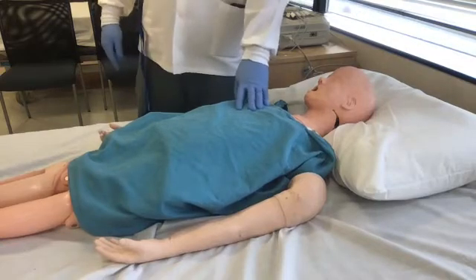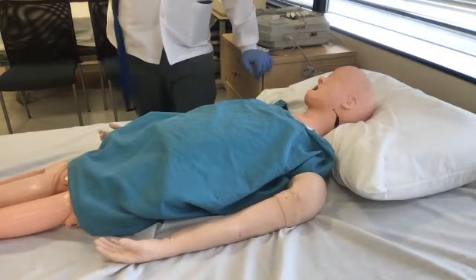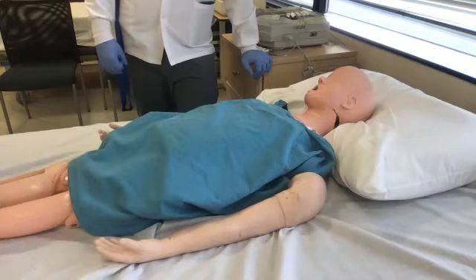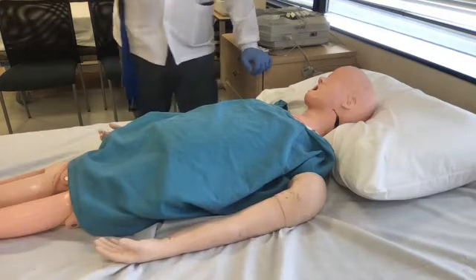So identify who he is. Then I have to tell them who I am. Hi, Mr. Marquez. My name is Nelson. I will be your tech today. Dr. Cassidy wanted me to perform an EKG on you. Is that all right? Have you had one before? You see what I'm doing? I'm garnering the rapport.